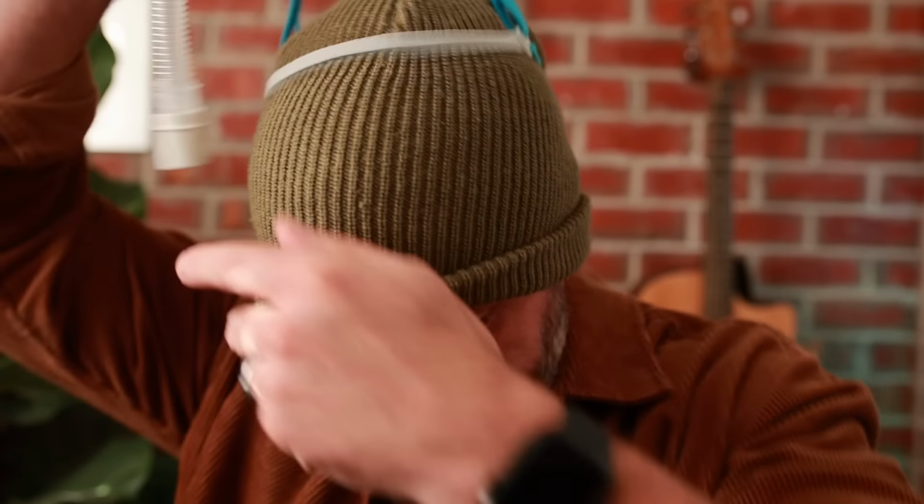Awesome. Actually, I wonder how it would go with your full size F20 mask. You know, the ones that come up over the bridge of the nose? I wonder if they actually push in there. Because if you're pushing in there, it's going to make it much harder to breathe through your nose. So these might be good. They might also work as a bit of a guard to help protect your skin. Might be onto something there. Right, so there's another tip for you. Little nasal dilating strips. Absolute winner.